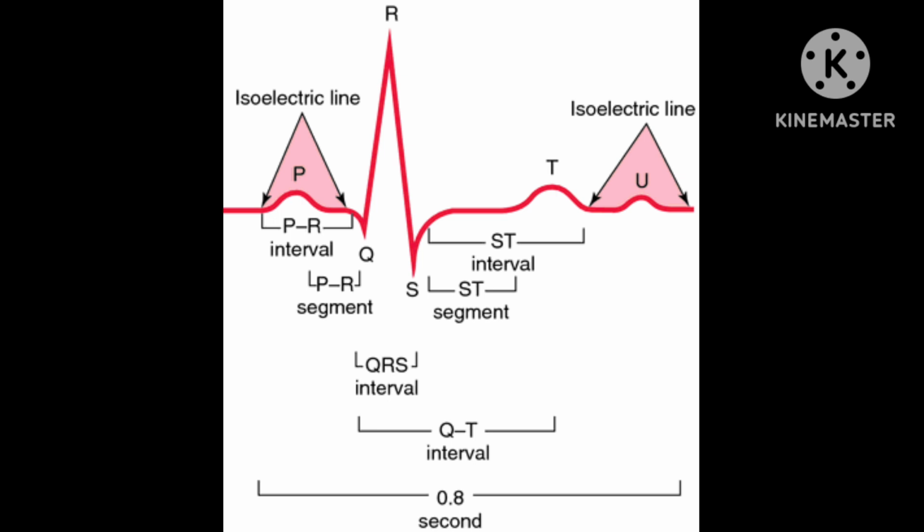This I have told, how this ECG functions or works. There is a main role, as I told you, for electrodes and amplifier.